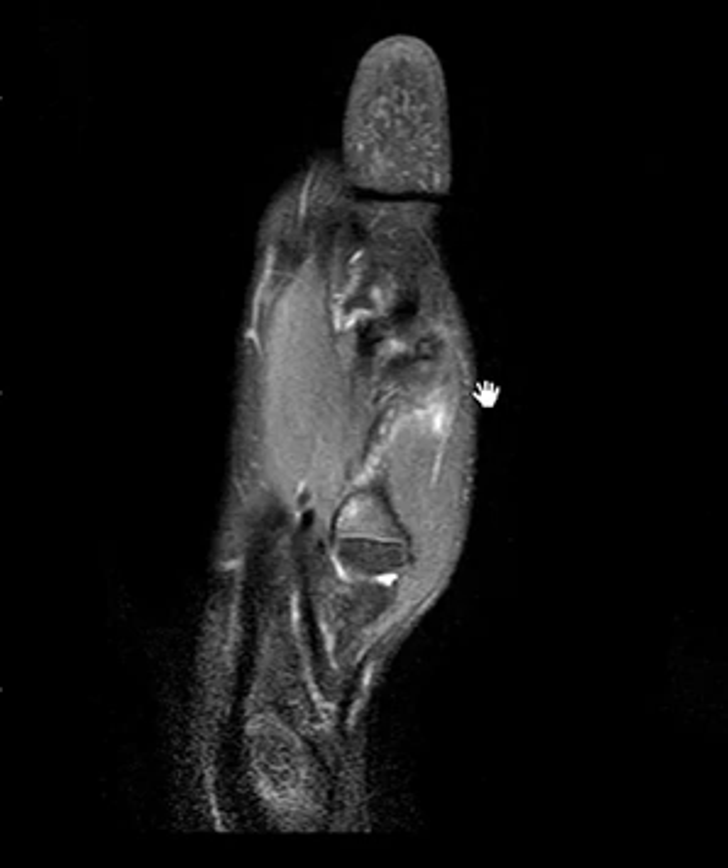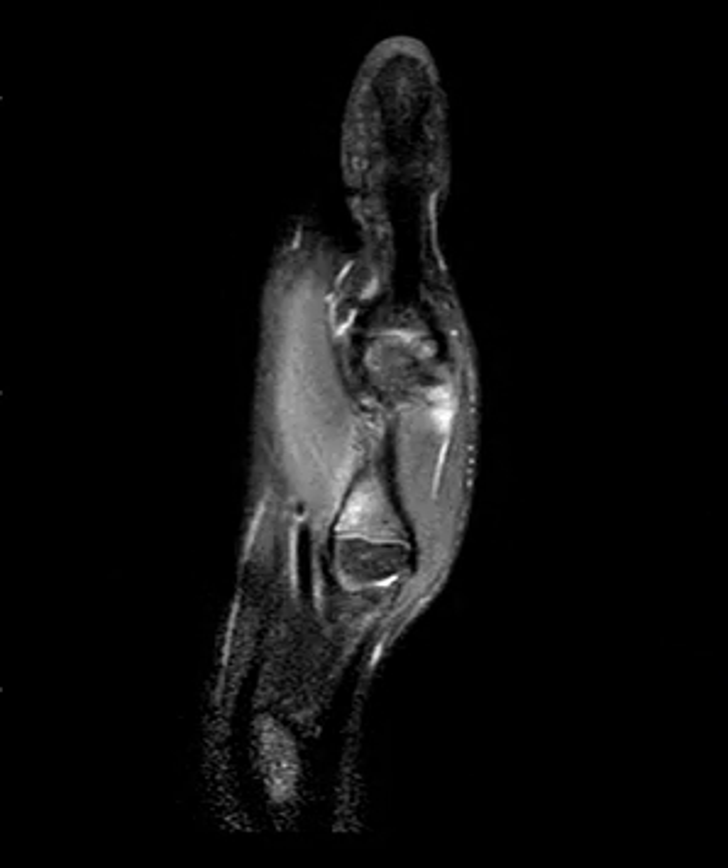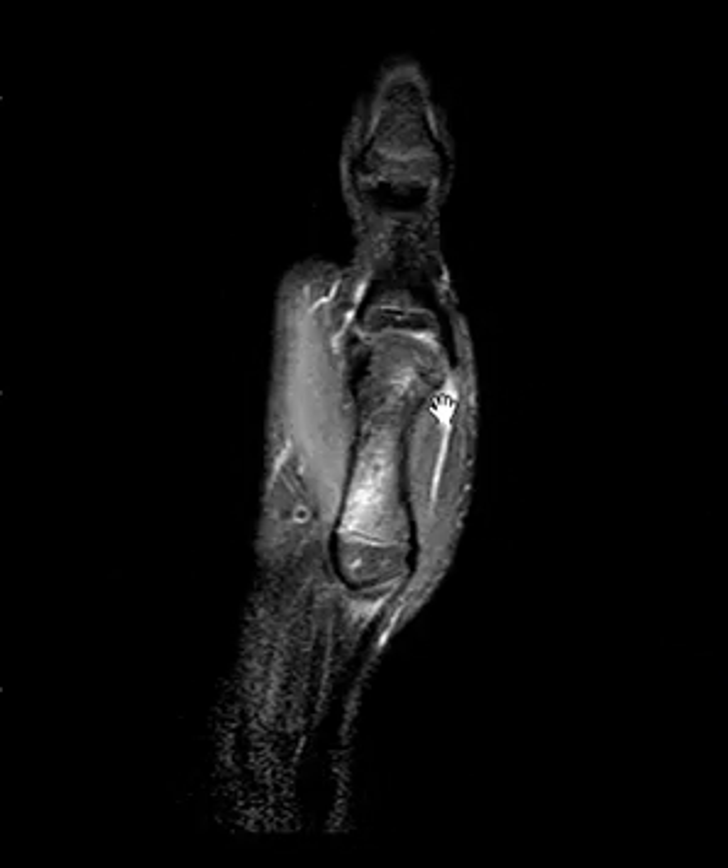Some people could argue, well, maybe it's a little thick, maybe a mild sprain, but definitely not torn. But there is something on the opposite side, over here on the radial side. We see a little collection of fluid or hemorrhage right over here. And this is the opposite side, so when the UCL gets injured, the thumb is stretched this way, like a ski pole injury, and it will yank on the thumb and stretch the ulnar side. This is the opposite side, so the opposite mechanism of injury. So this is probably okay here, and we have something else.